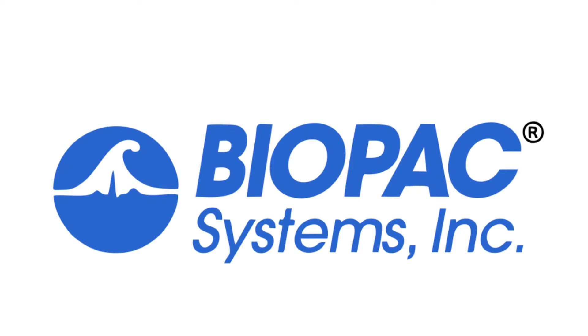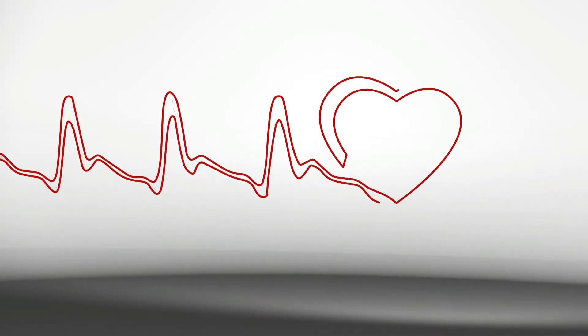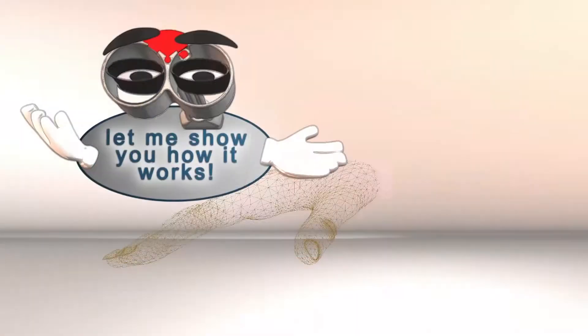Now available from Biopac Systems, the CN Systems NIBP100DHD monitors blood pressure and advanced hemodynamic parameters in humans. Continuous, non-invasive, and reproducible — this allows enhancing your research work with advanced hemodynamic data all from one sensor.